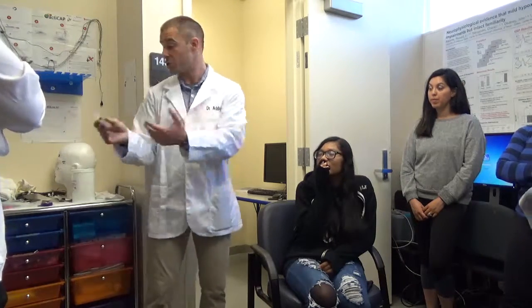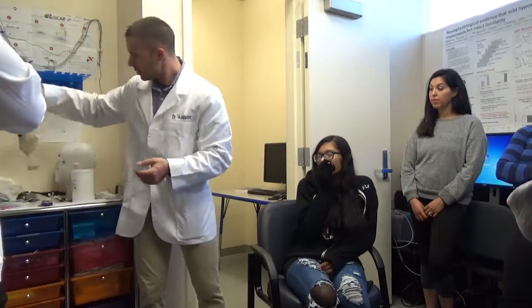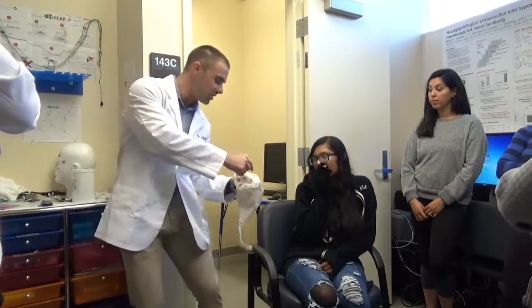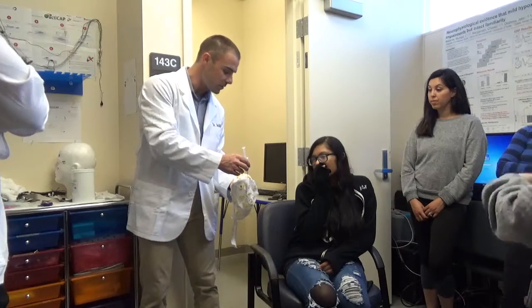Okay, so in the consent process, we're telling them ahead of time, this is what we're going to do, and we're showing the equipment, and we're saying why. We explain that brain signals have to jump from the brain, through the skull, to the electrode, and it reaches impedance along the journey, and we want to overcome that impedance by getting through some of that dead skin. We only use this little syringe because we've got a tough job. We've got to get gel into these tiny little capsules. The way that we do that is just through a syringe, and it just fits in there, nice and easy.